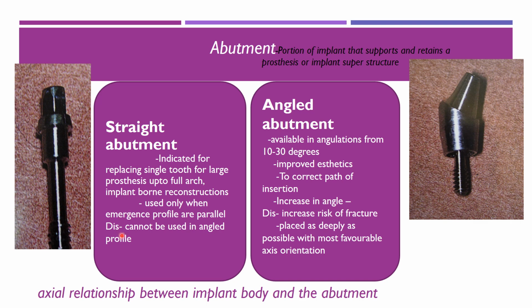The disadvantage is that it cannot be used in an angled profile, whereas this angled abutment is available in angulation. You can see that it is angulated. Mainly it is used for anteriors. So improved aesthetics and correction of path of insertion can be achieved. Increase in angulation, increase in angle. The disadvantage is increased risk of fracture, and it is placed as deeply as possible with the most favorable axial orientation.